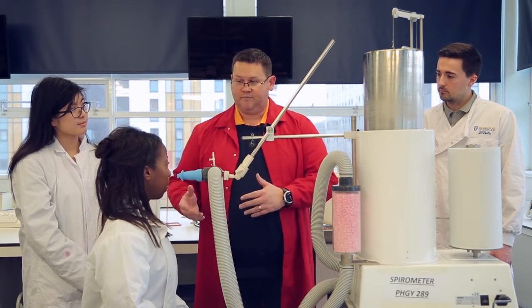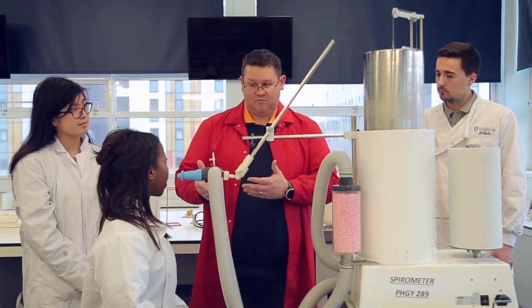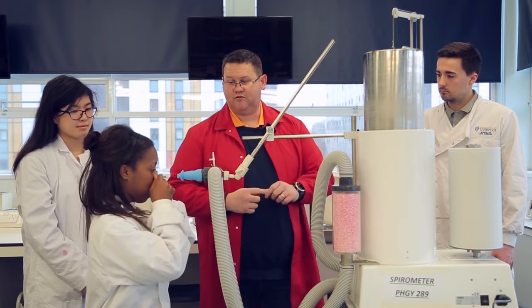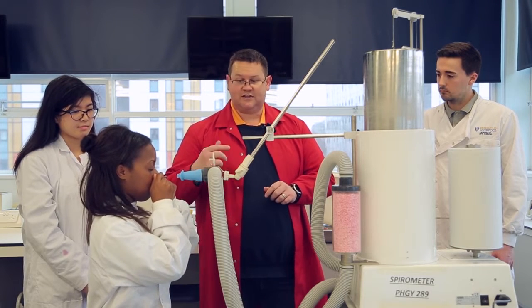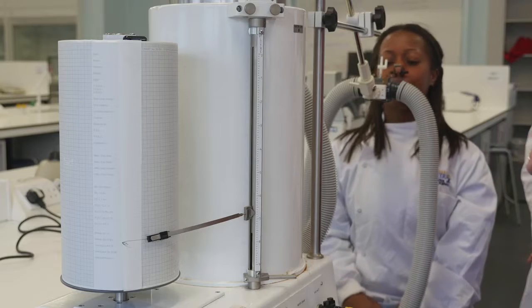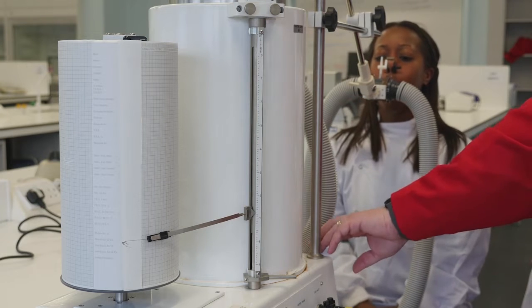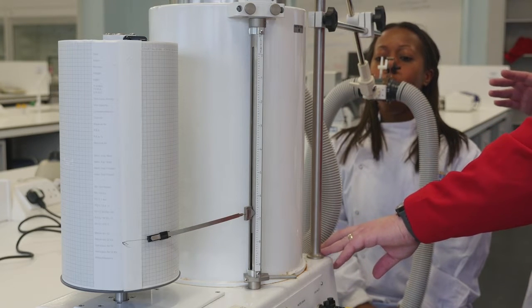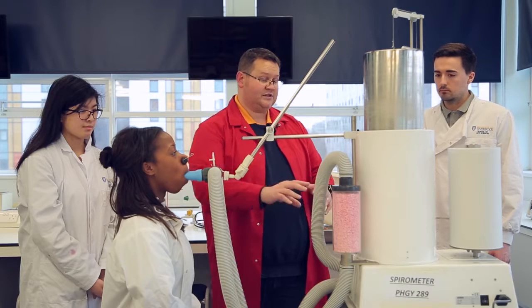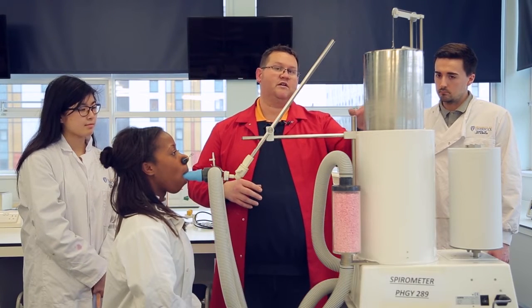What you're going to do is sit, relax, pop the mouthpiece in, and before you do, pop the nose clip on, because we want to make sure that all of the ventilation going on is actually coming through your mouth. If you want to put yourself comfortably and offer yourself up to the mouthpiece — that's it. You'll notice that nothing's moving, nothing's changing at all. You are able to breathe; what's happening is you're breathing through the atmosphere, as there's a set of valves underneath that allows us to breathe through the atmosphere rather than the gas contained within the bell.